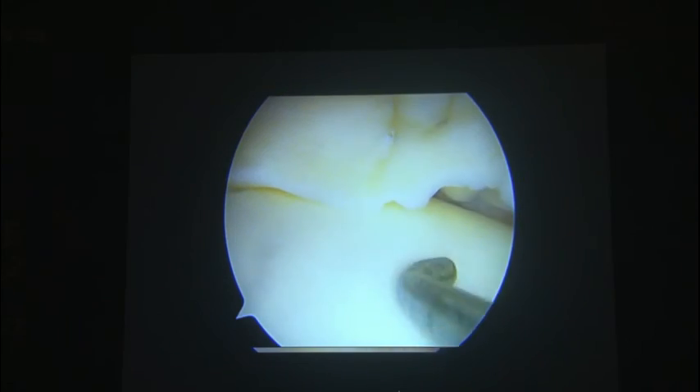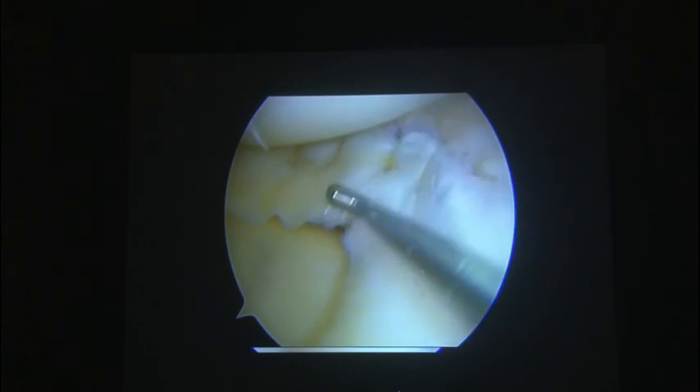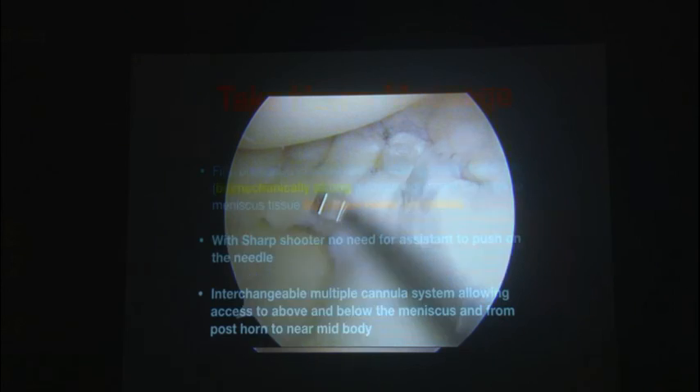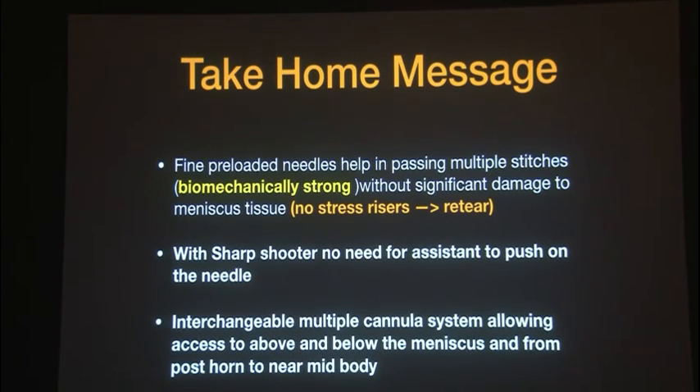Three to four stitches above and three to four stitches below gives you a stable repair. On the table itself, this knee has been moved to 90 degrees, so you are very sure that the patient can be mobilized to 90 degrees as early as possible. These patients do extremely well and achieve their range of motion very early. Take home message: use fine preloaded needles which are biomechanically strong and do not create stress risers, reducing the risk of re-tear. Whether it's the Sharpshooter or the Zone Navigator, any of these devices work very well. Use zone-specific cannulas to your advantage in the posterior horn and the mid body. Thank you.